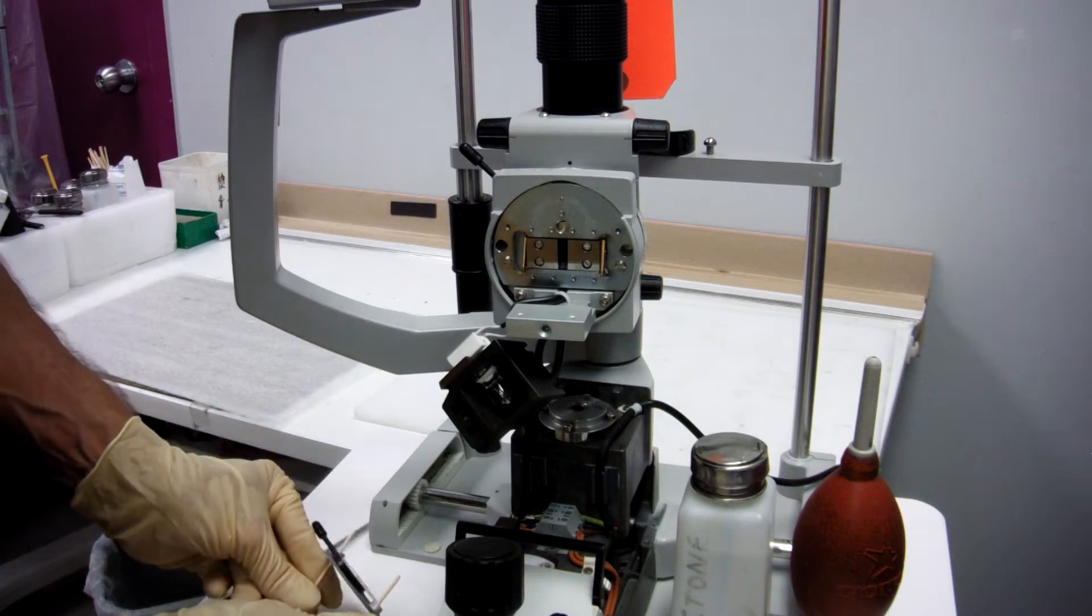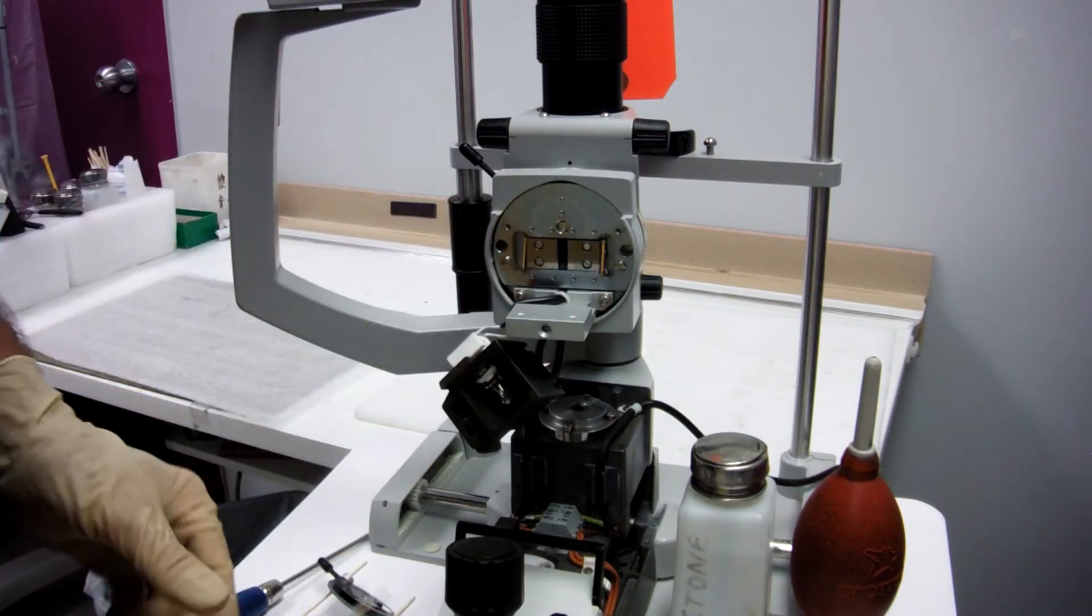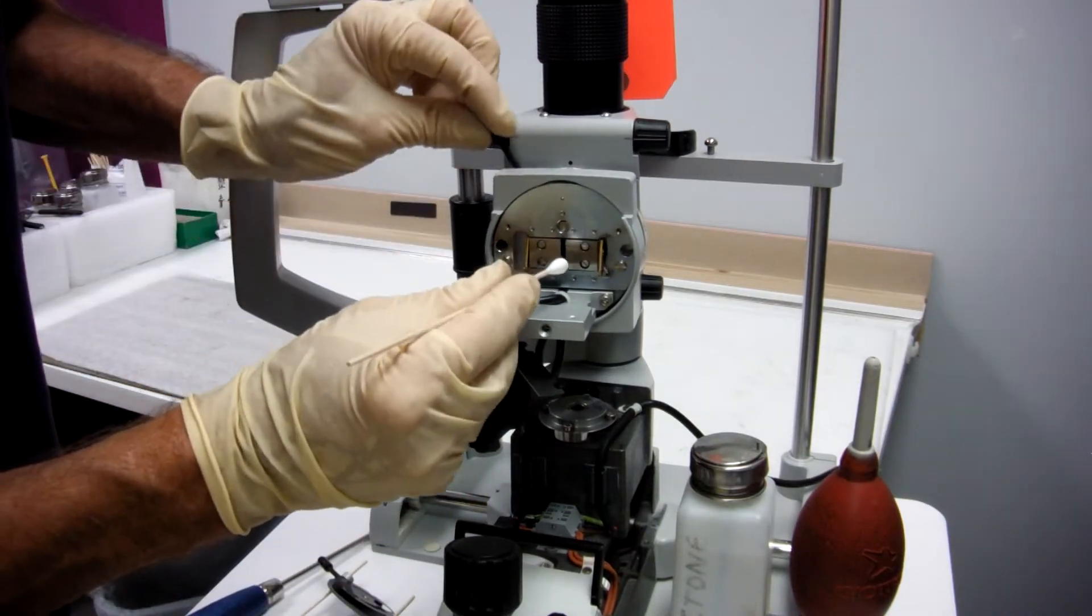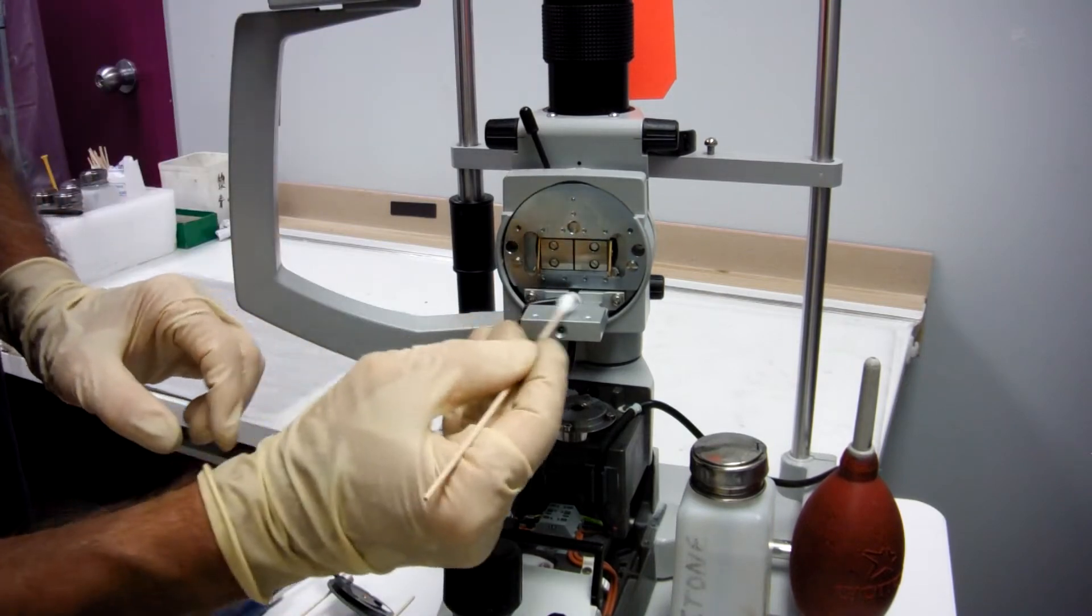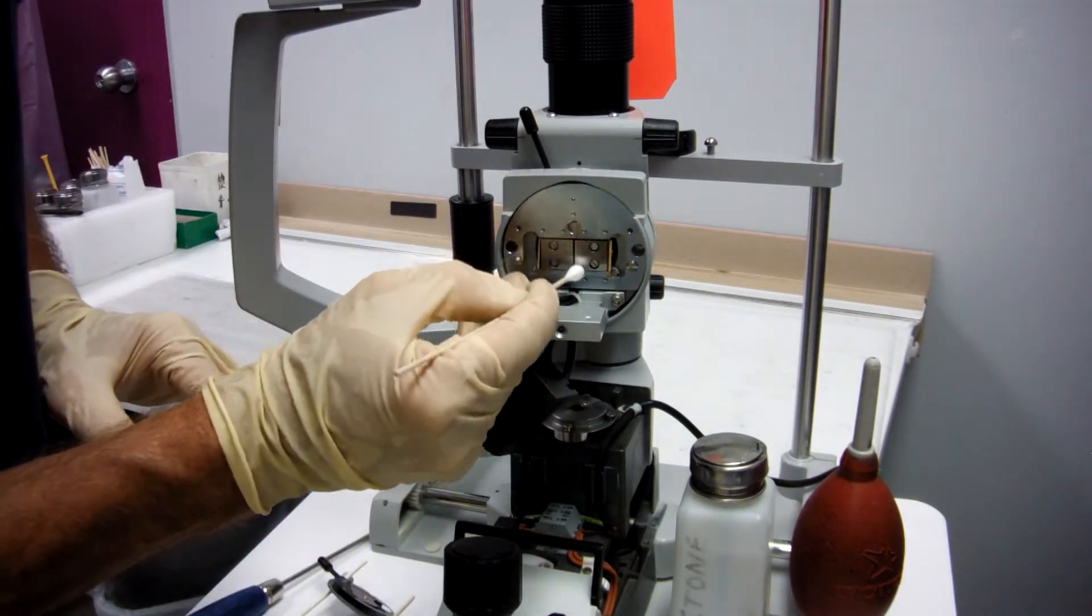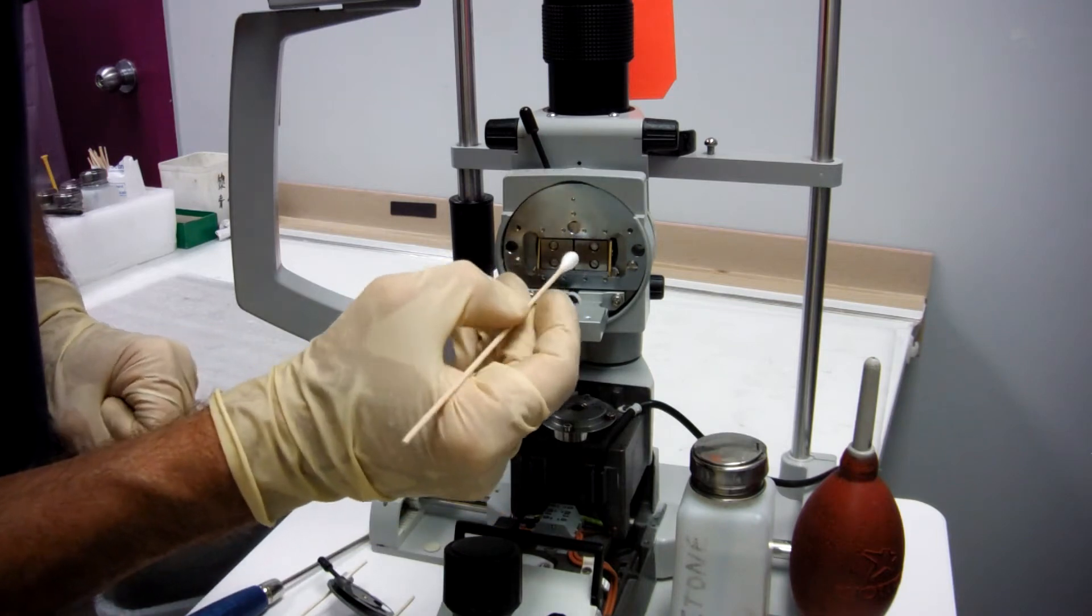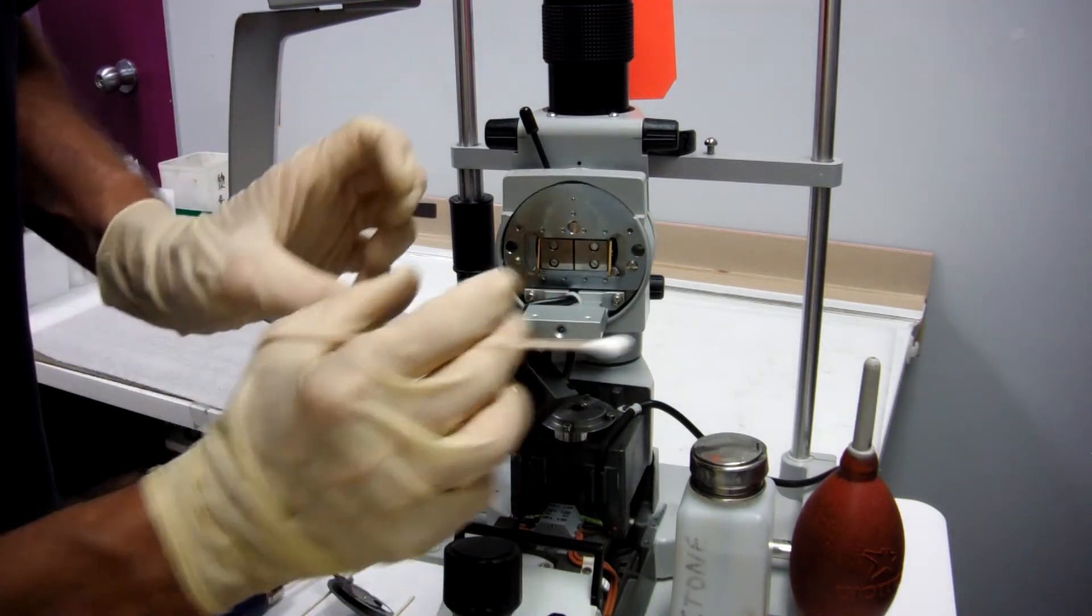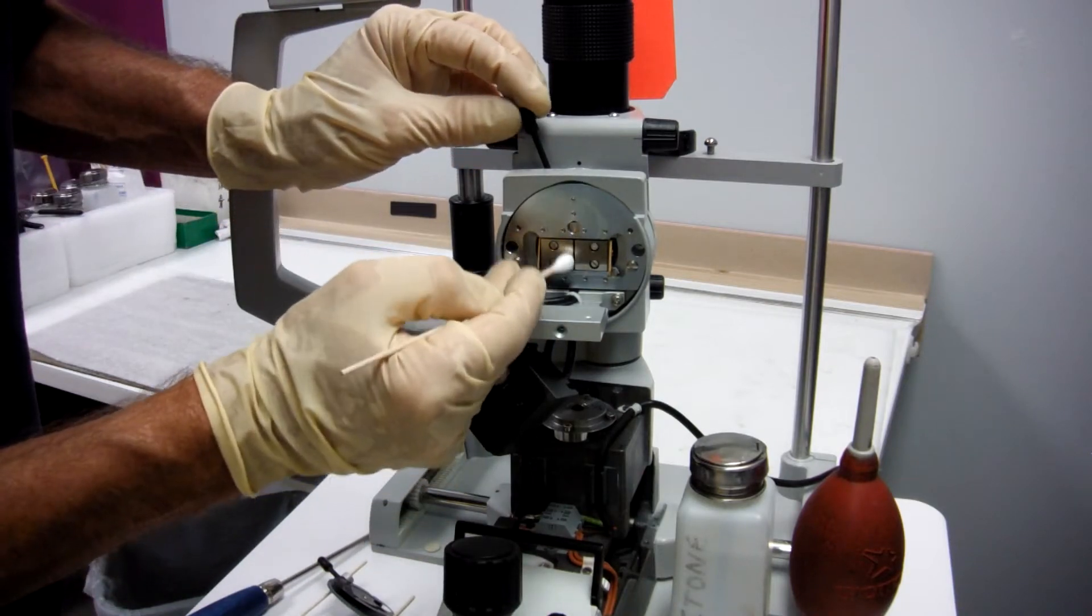But right now we're going to try to clean these slits a little better. They're not closing all the way and there wasn't enough room to get the entire surface just through the largest hole in the diaphragm. So we've taken off the diaphragm assembly so we can get to these slits all the way.